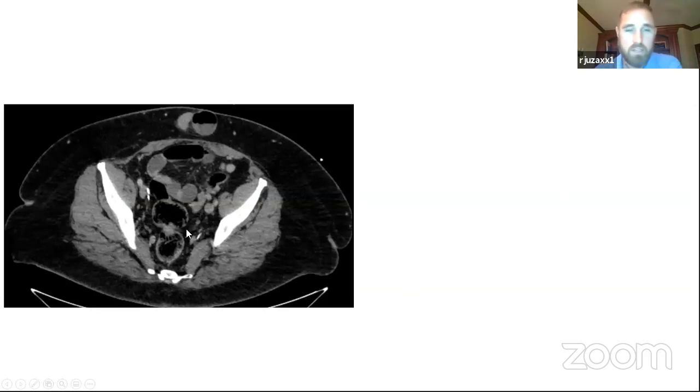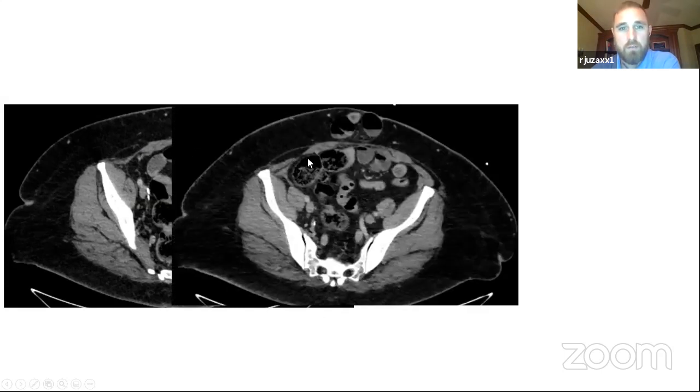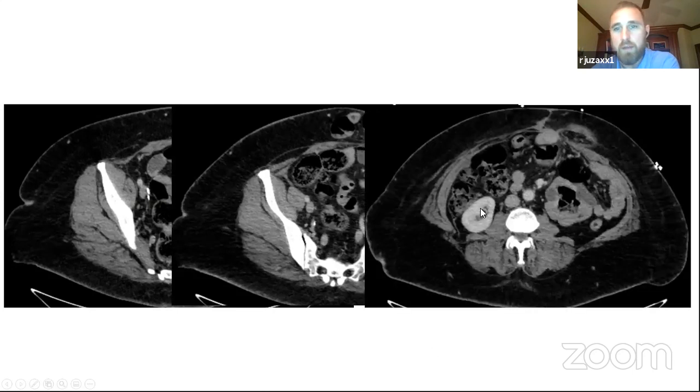So what does that look like in somebody? This is a patient of mine who had a Kocher incision. So if we watch her deep inferior epigastric system here, all right, and as we progress superiorly, we still see it here. She's got a ventral incisional hernia, and then we get to their upper abdomen. Here's an area of her Kocher incision.